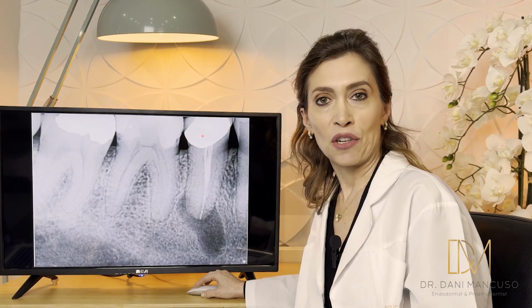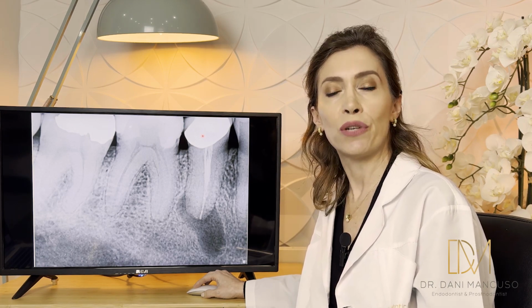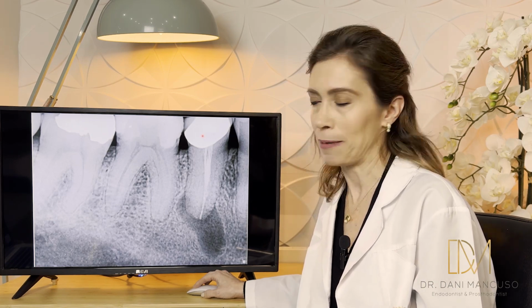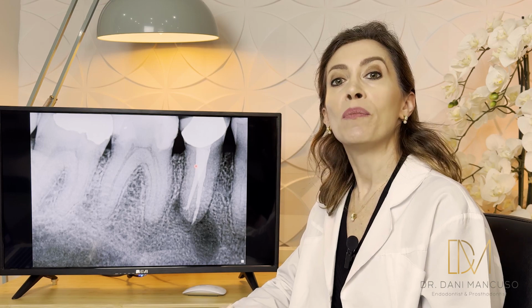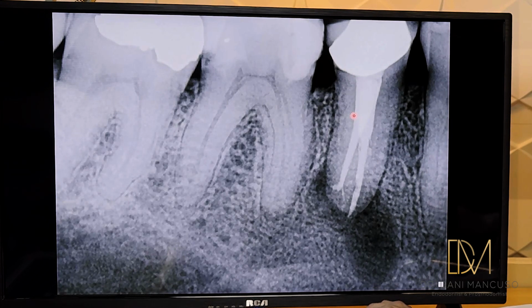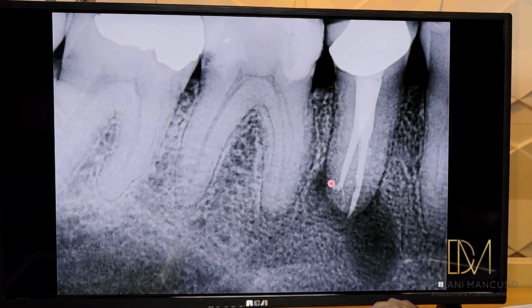The dentist suspected an untreated canal because of the configuration, and he started the retreatment, but he struggled halfway through and couldn't reach the length correctly. When we took the CBCT, I could clearly see the root filling that we saw initially, and that he was going in a different direction and had fractured a file over here. We then started over again, removed the fractured instrument, and found that canal. The reason why he was struggling as well was because the canal was curving in that direction here.